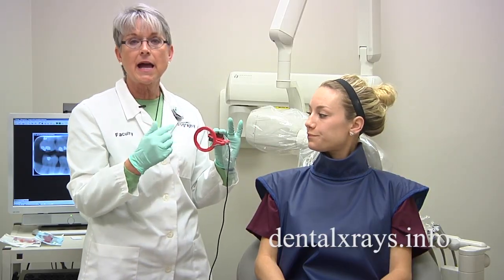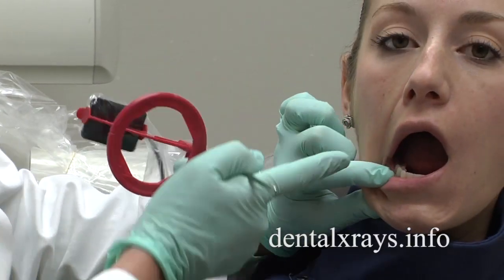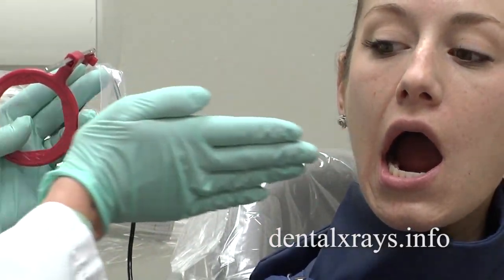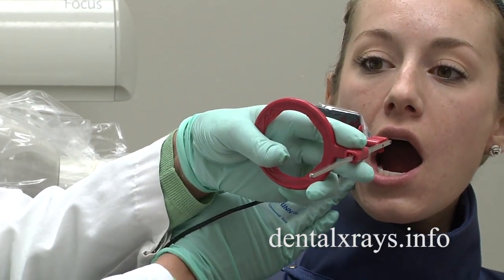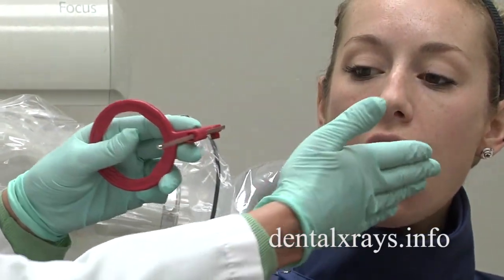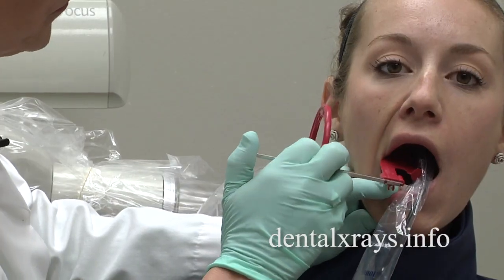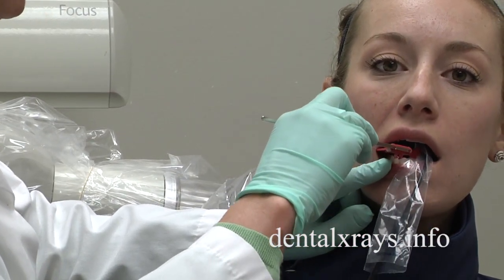So what I like to call is thinking outside the circle. What I'm going to do is see where her contacts are coming in. If I want to have this beam coming in to make the contacts open and it's twisted like this, I'm going to have to think outside the circle and bring my cone coming this way. So again, I'm going to place it in the patient's mouth, twist it so it's a cross arch, and have the patient bite down.